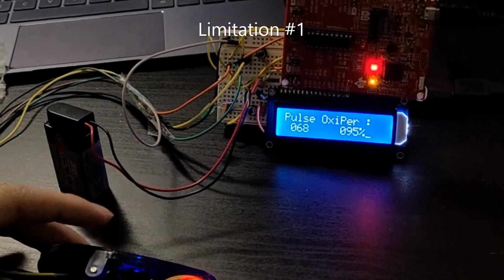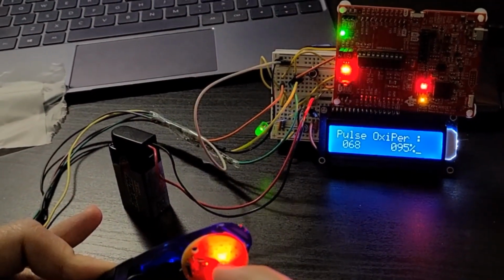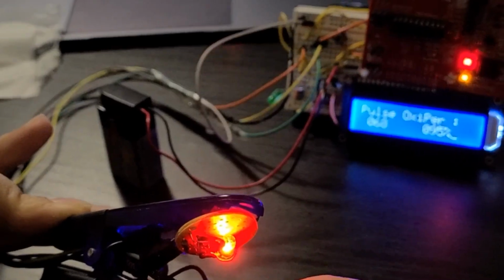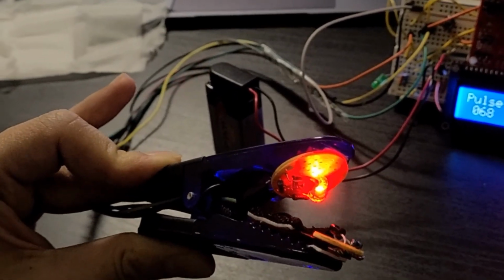In this video I want to talk about a few limitations of this design. In our clip, the phototransistor and the LEDs aren't perfectly aligned. So the adjustment of your finger really matters. You have to position your finger at the exact center of the LEDs and the sensor for the best results.